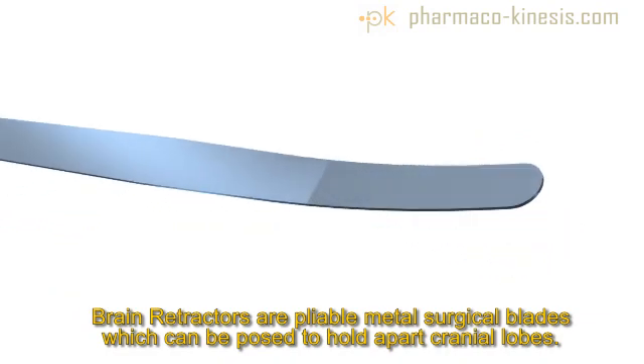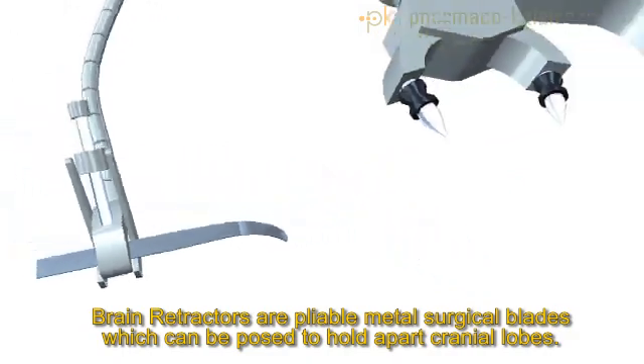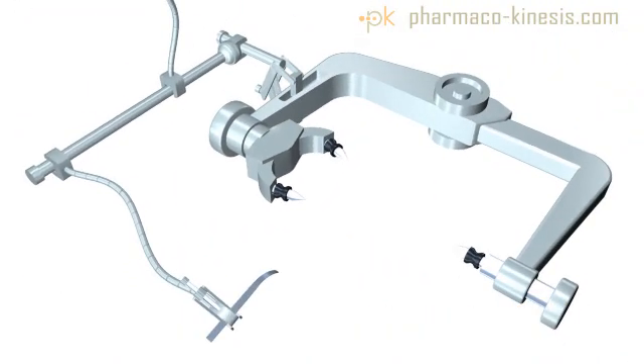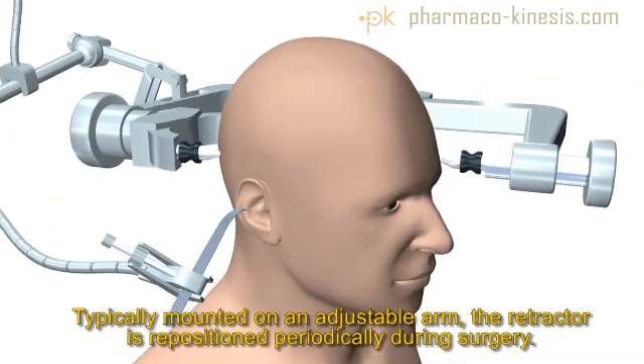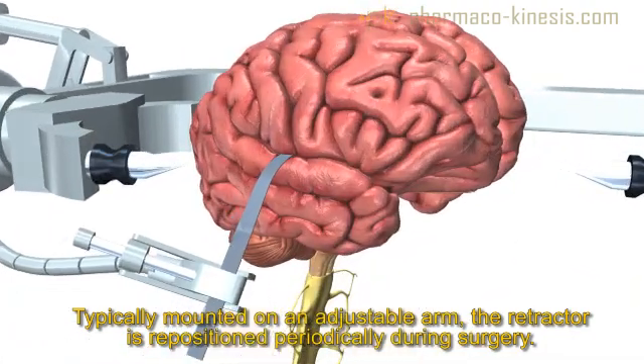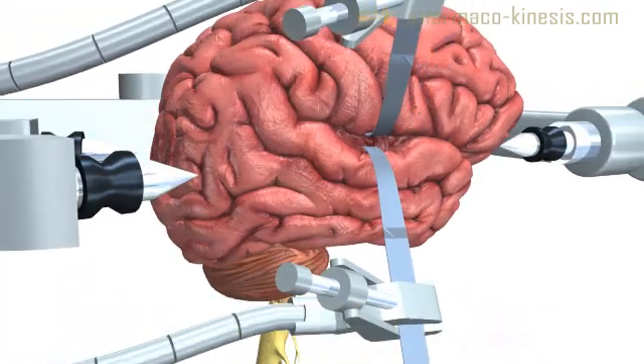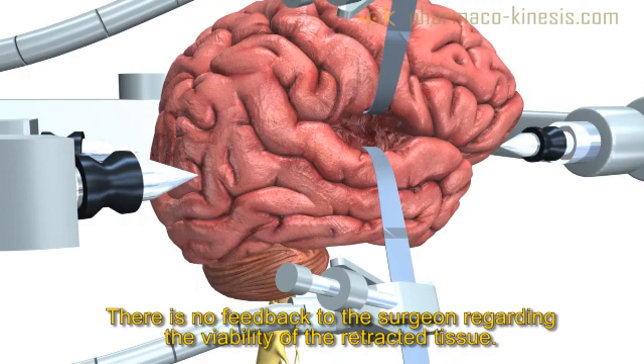Brain retractors are malleable steel blades, typically attached to a flexible snake mounted on a stationary base such as a Mayfield head holder. They are bent into any position required by the procedure to physically hold apart lobes of the brain, and can be detached and repositioned by the surgeon if needed. However, there is no feedback from the retractor to the surgeon whether a retracted region of the brain is injured or at risk of injury.